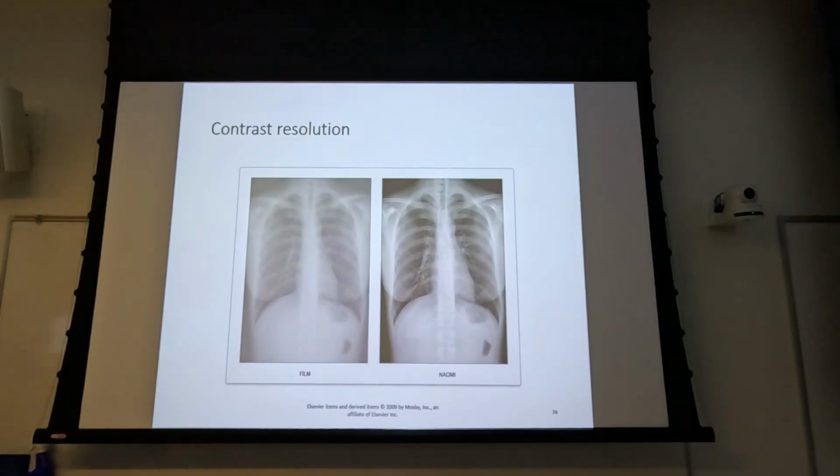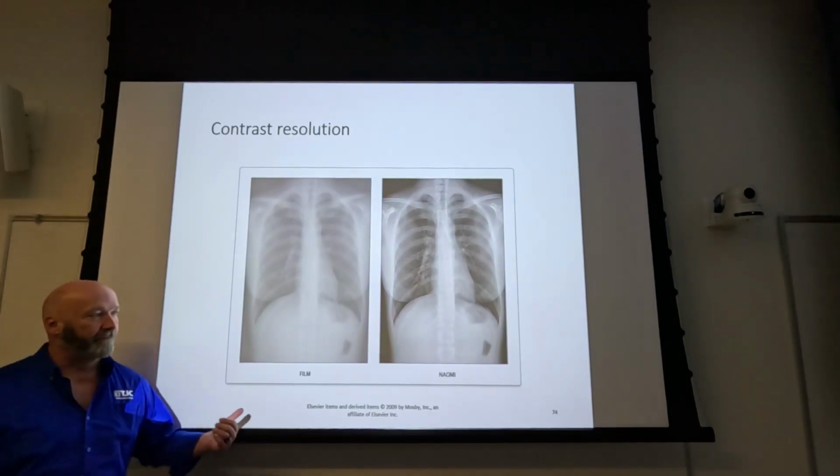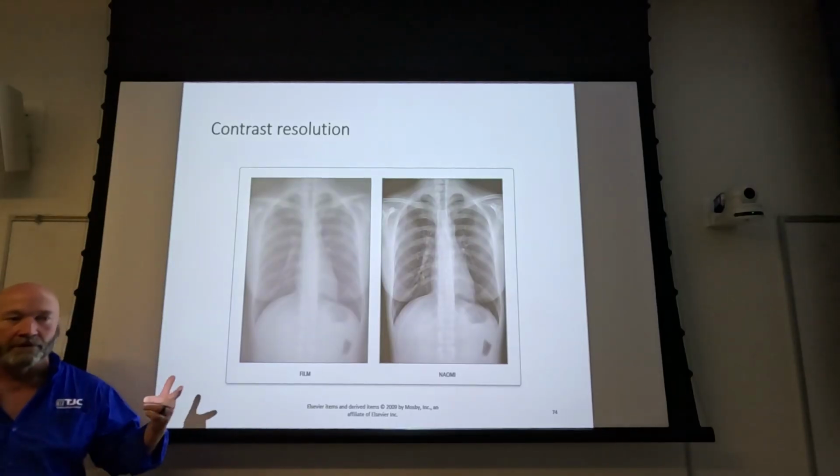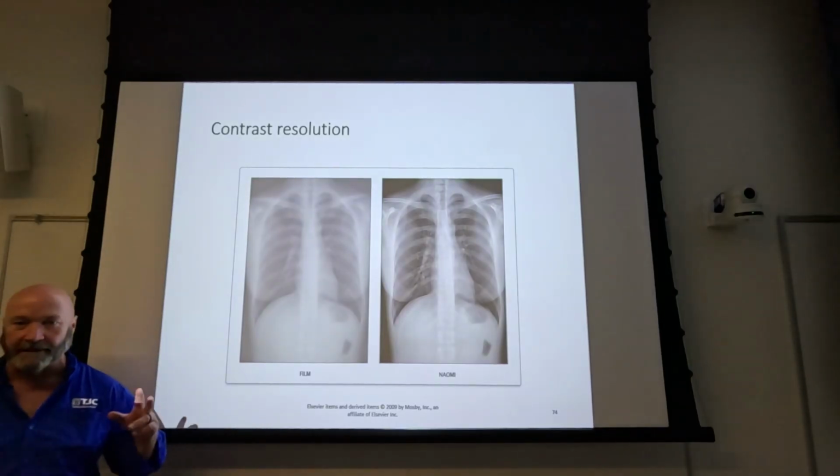So this is what we used to get with the difference between, you know, high KVP and lower KVP, or possibly with and without a grid. Now, we never really had to use a grid for a chest x-ray, and the textbook answer for why you don't need a grid with a chest x-ray is because of the natural air gap.